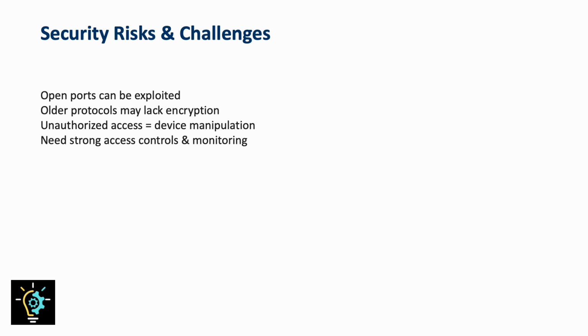To reduce risks, engineers must enforce strict access controls, encryption, and firewall rules. Regular updates and monitoring are also key. The takeaway: ports and protocols are double-edged swords. They enable life-saving communication, but if neglected, they can introduce vulnerabilities into healthcare systems.